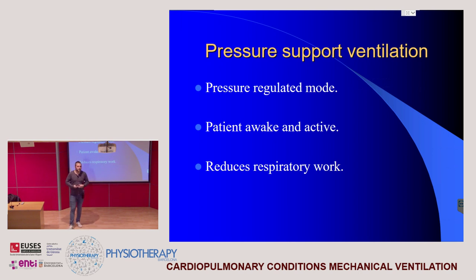So it means that his respiratory muscles have to perform their work normally. In the first steps of this spontaneous ventilation, the muscles could be tired or decrease their strength, and the pressure support ventilation, or the ventilation during the spontaneous modes, will help to reduce that work. So that will help the weaning and extubation process.